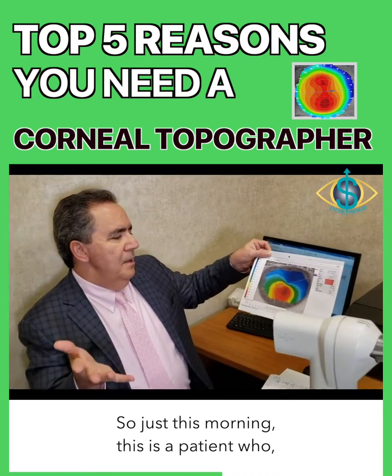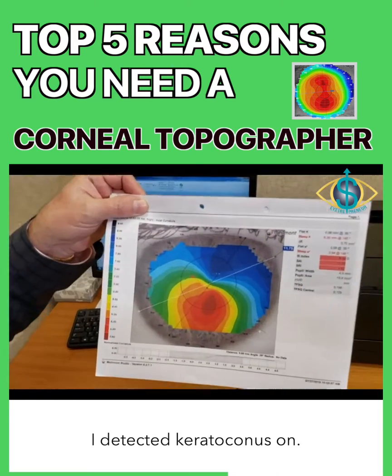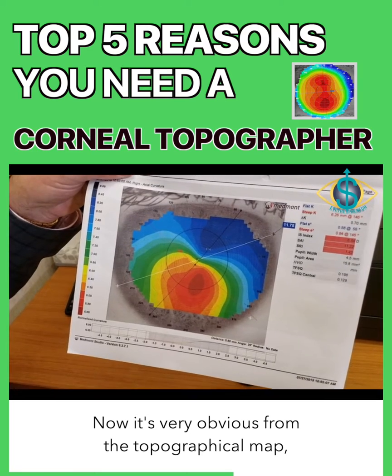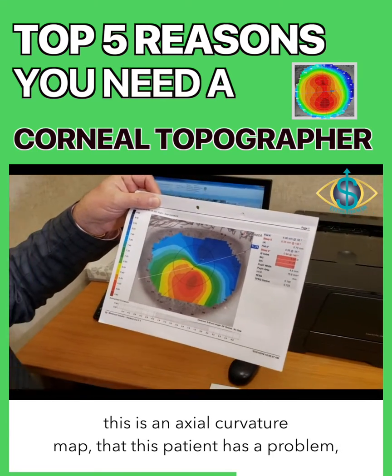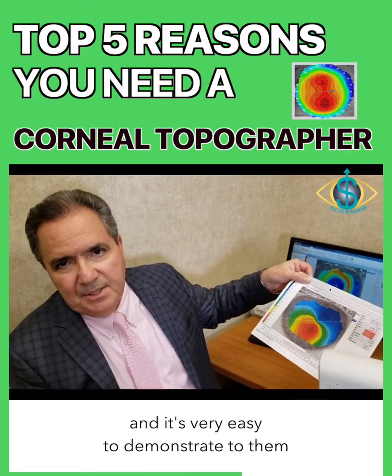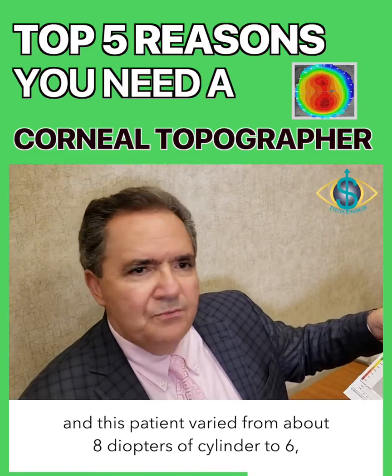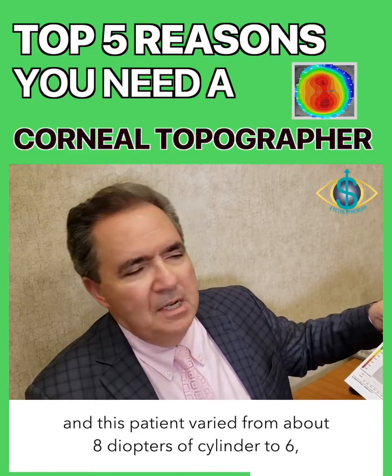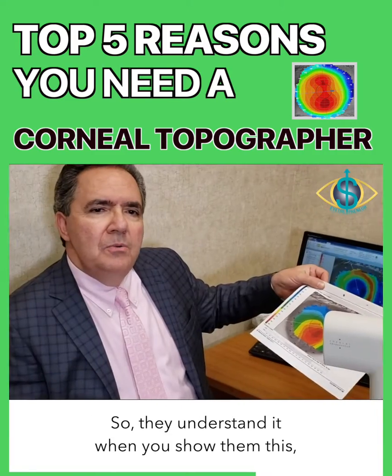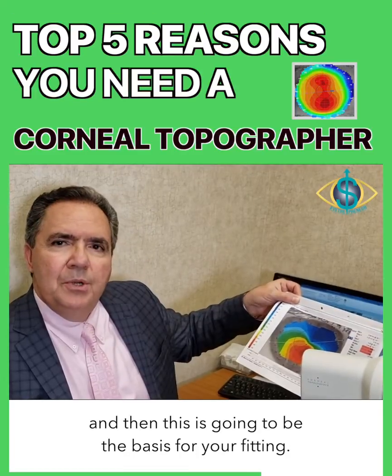So just this morning, this is a patient who I detected keratoconus on. Now it's very obvious from the topographical map, this is an axial curvature map, that this patient has a problem. And it's very easy to demonstrate to them why they're not seeing well out of their glasses. And this patient varied from about 8 diopters of cylinder to 6, and the sphere from 1 to -5. So they understand it when you show them this. And then this is going to be the basis for your fitting.